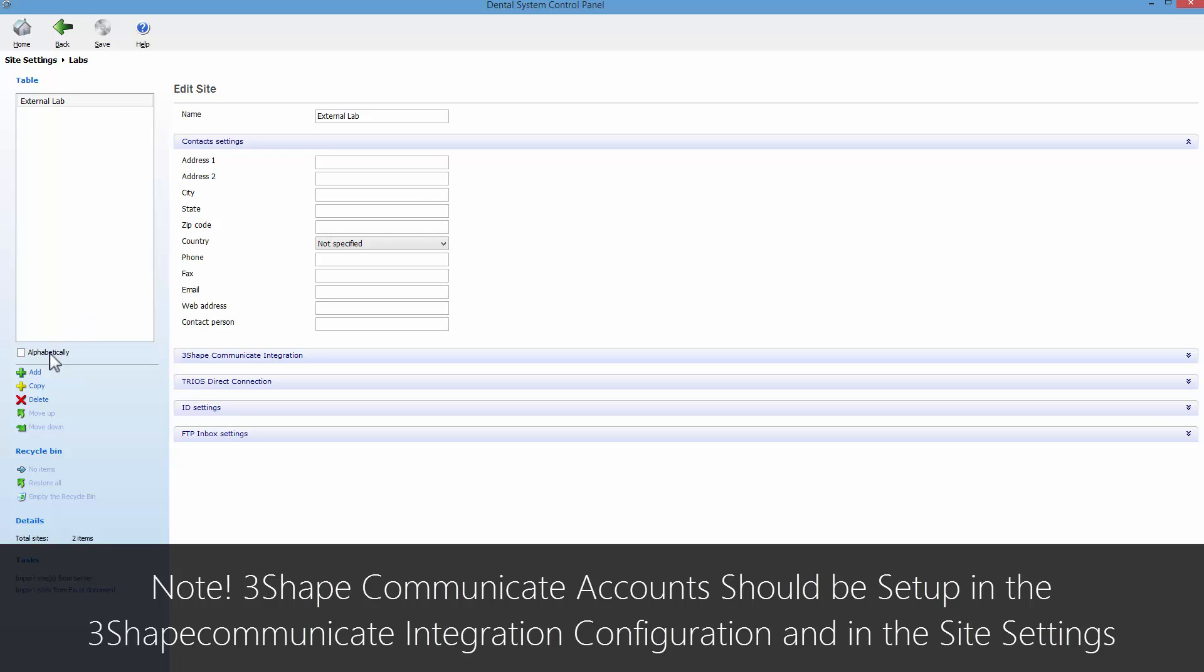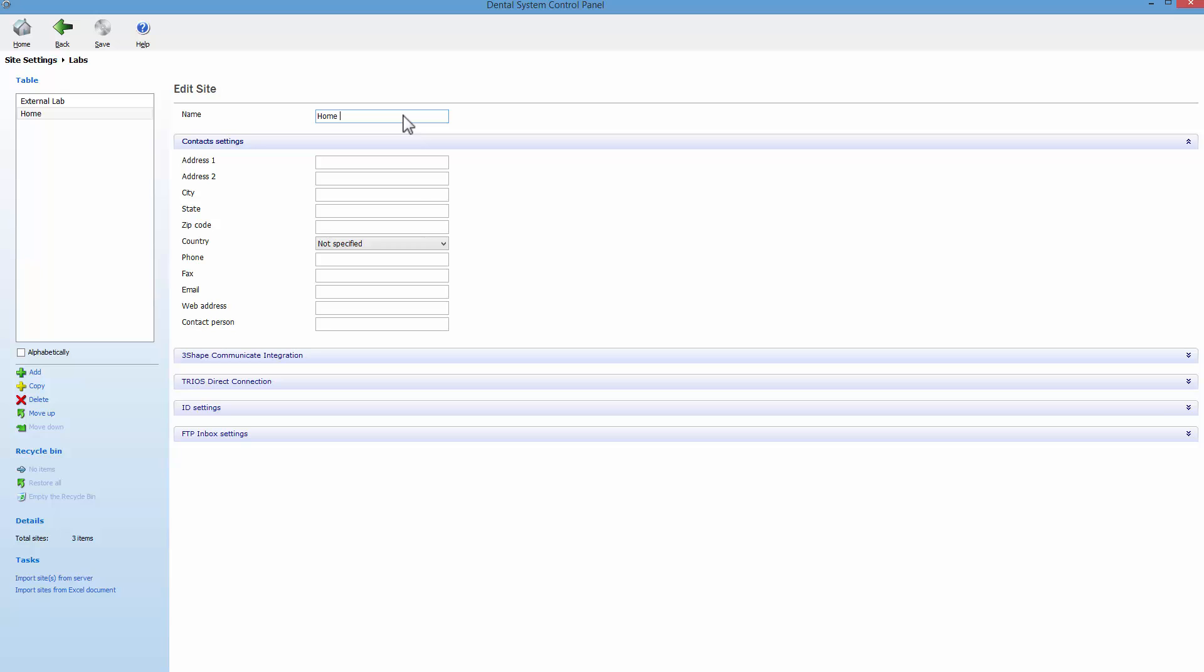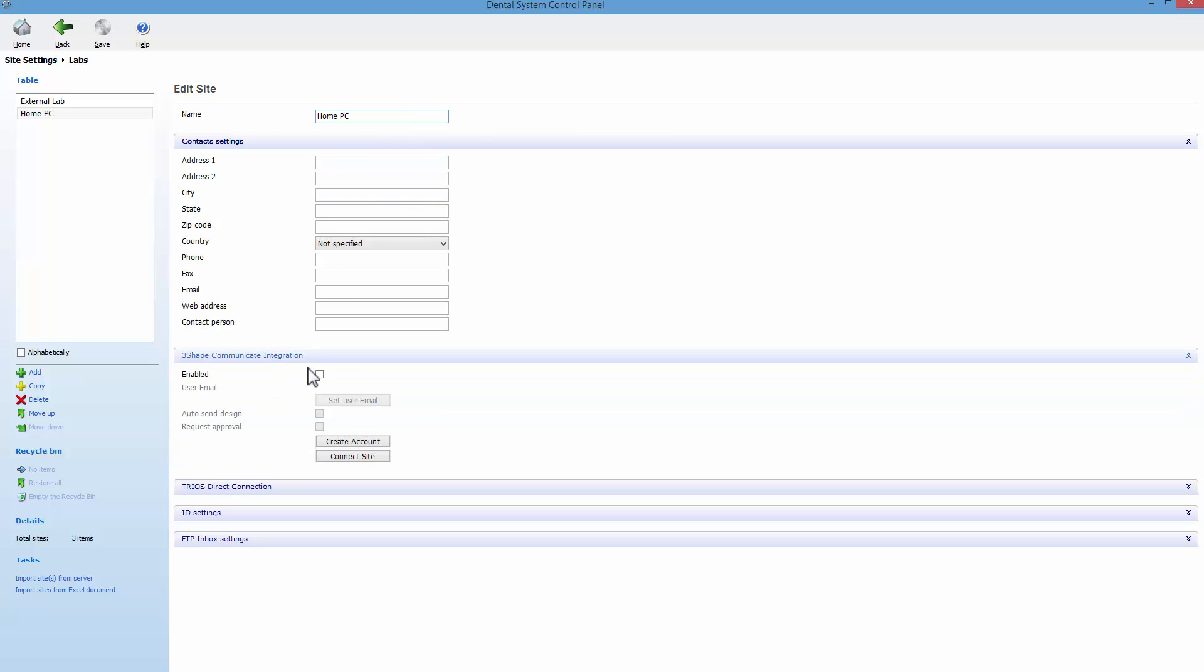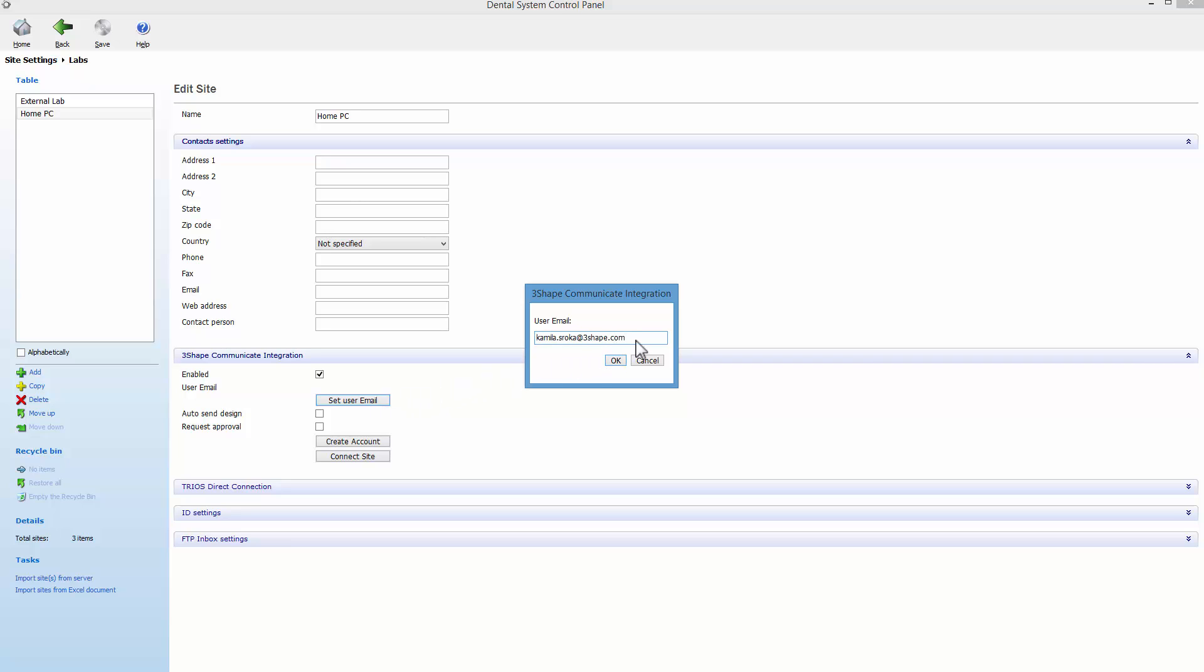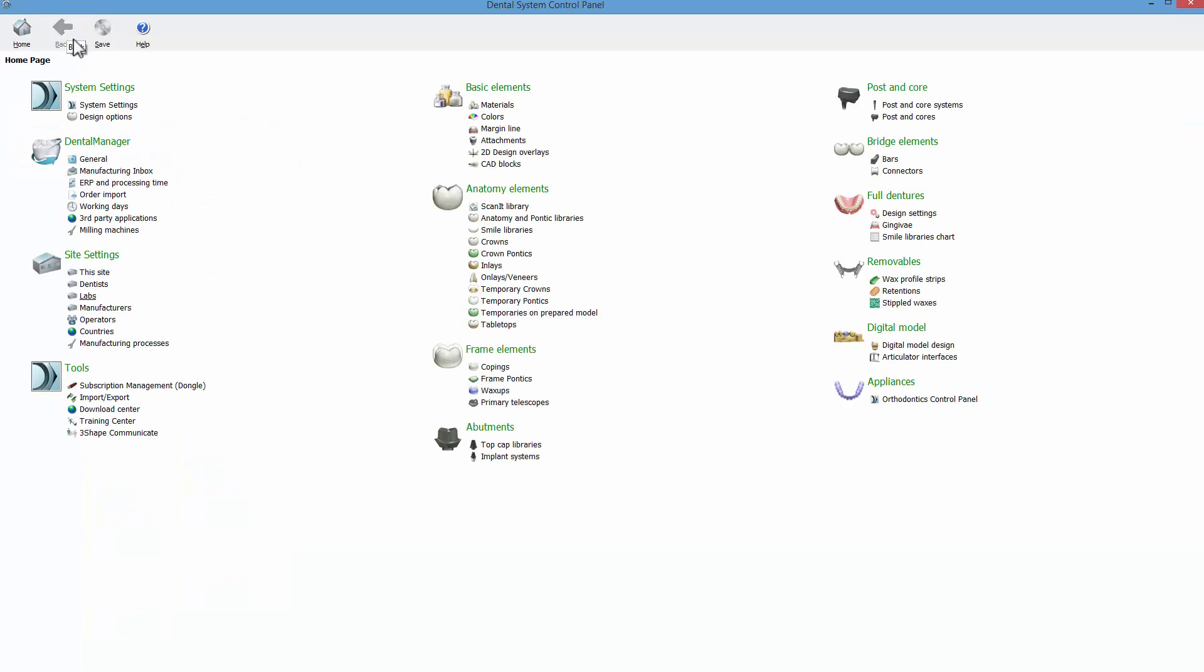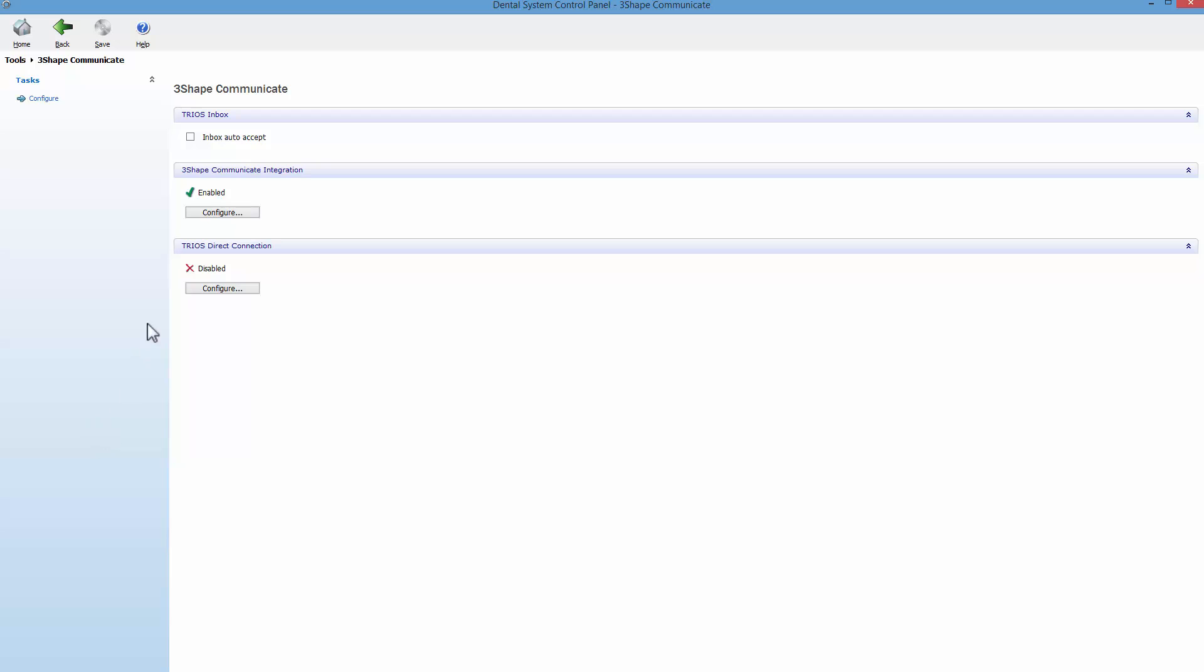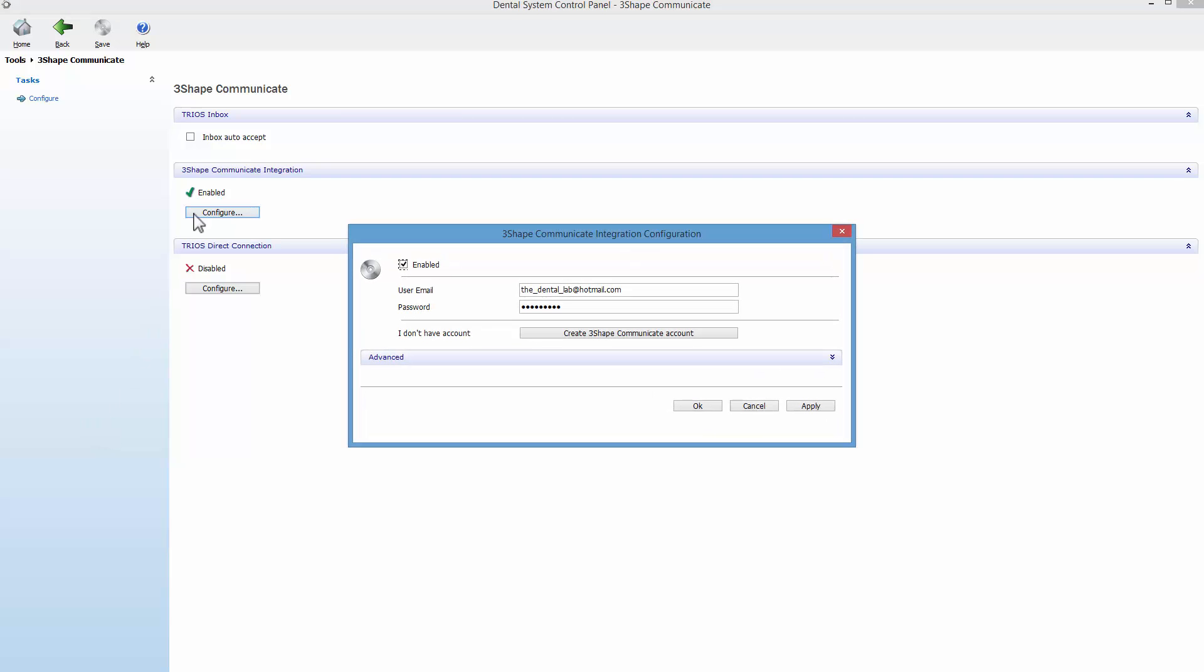Remember to add your home PC or other workplace as a new lab in the site settings, and enable the 3Shape Communicate integration. Also notice that with that workflow you have to have two separate email addresses, and you need to create two different 3Shape Communicate accounts.